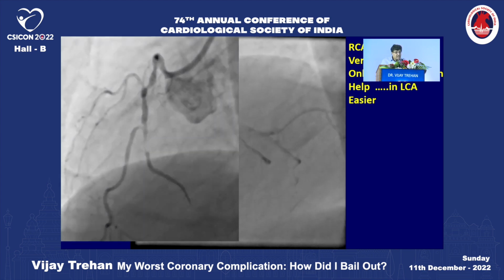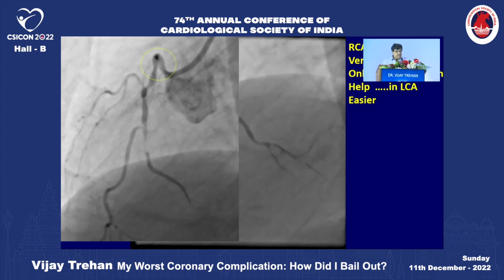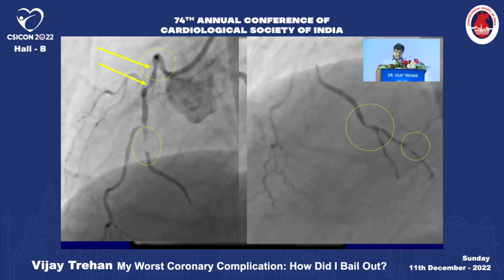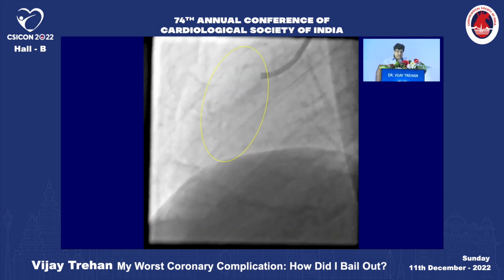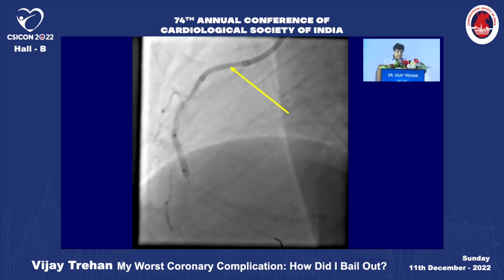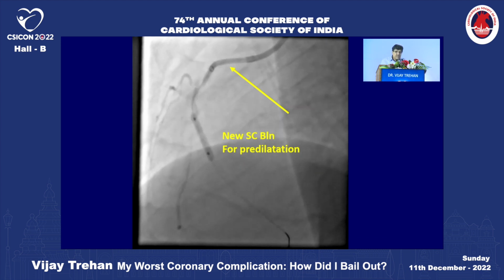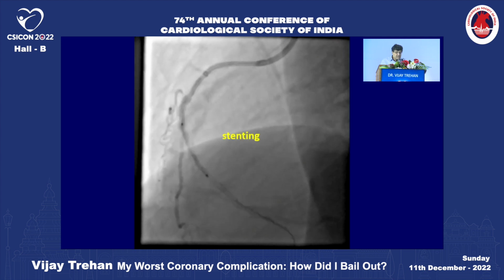But it looked easier, though if you see it carefully, you start finding problems in the beginning, small little problems in the middle, a tight lesion, and also a lot of work to be done distally. What was not seen in the referral angiogram was calcium, and this is a pain. In fact, the first balloon for dilatation, a new semi-compliant balloon, refused to enter. It required the help of a guide extension. So my problem started there.